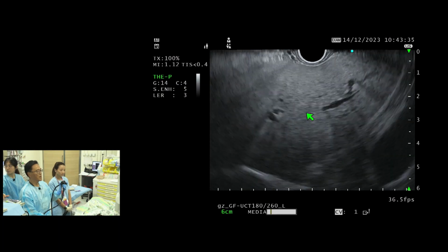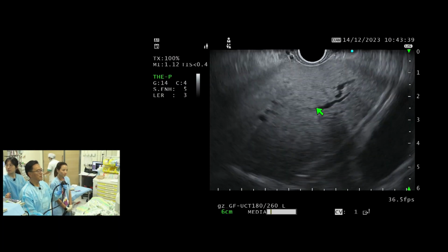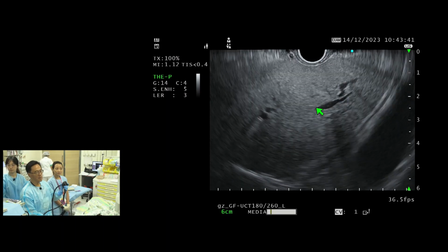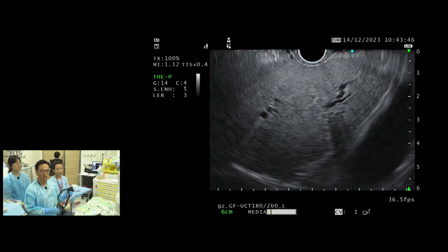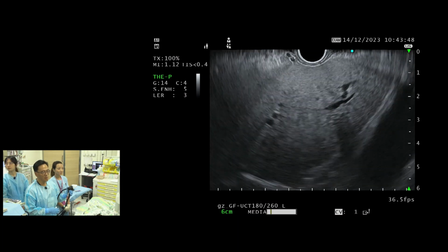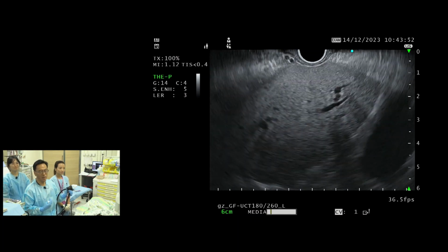Like here, there may be an opportunity right here between those vessels up there. But because of sterility and so on, I don't think that's going to be something that will go to clinical use, because the transjugular approach is done so well and sterilely.